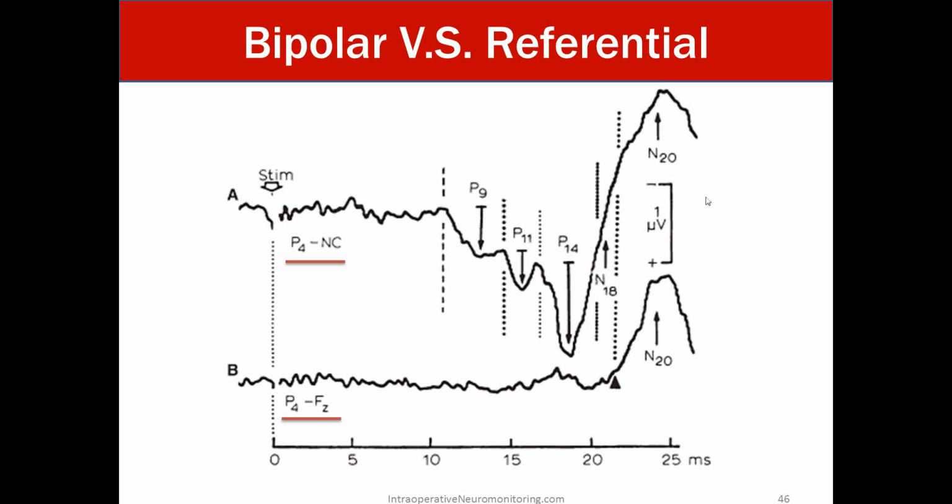But here we see the N20 coming from our stim artifact, P4, so I know we're recording on the right side of the head. Since it's the upper extremity, I know we must be stimulating off the left side.